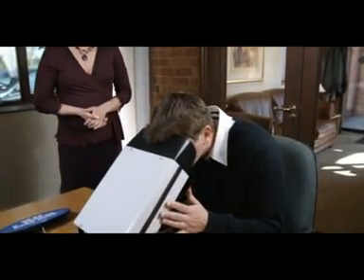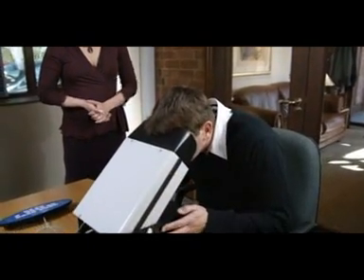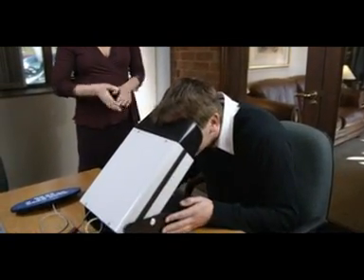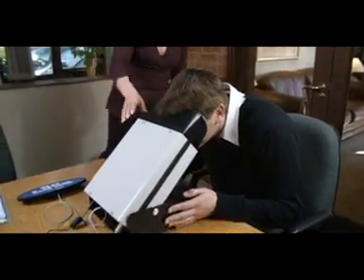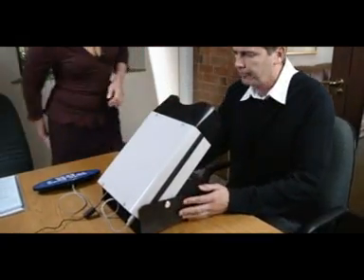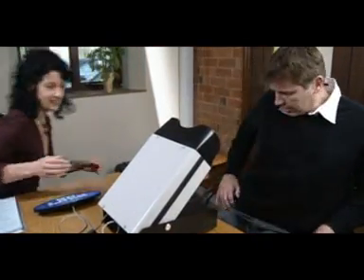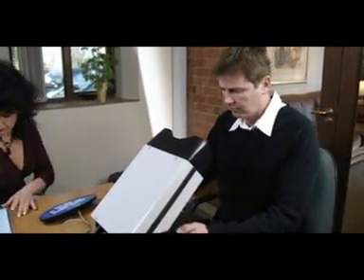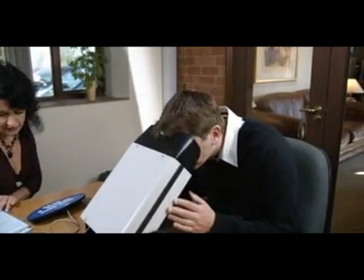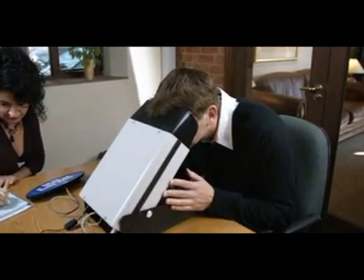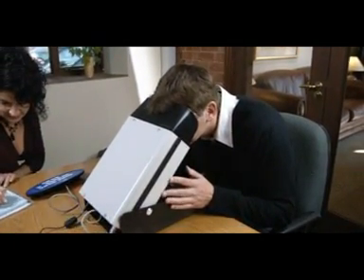There is a sensor inside the viewfinder that will detect whether the face is properly aligned. If it detects that it's not properly aligned, the backlight inside will go off. If this occurs, the face needs to be realigned.